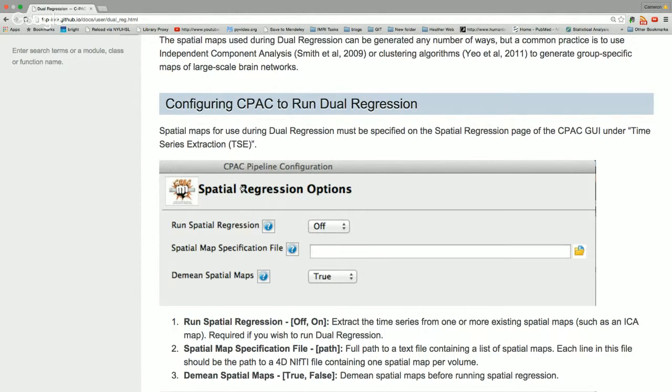So this comes out of FMRIB. I don't know that they have a very good publication that fully describes this, but it's become a very common thing to do. And you can do this in a multiple regression. So how I use this is I don't do ICA. Instead, I use templates that you can find from Steve Smith's PNAS paper, where he looked at the correspondence of networks between resting state and task, because I think those are a really good source. And I use those to define the networks and just pull those out. And you can come up with different ways of doing that.